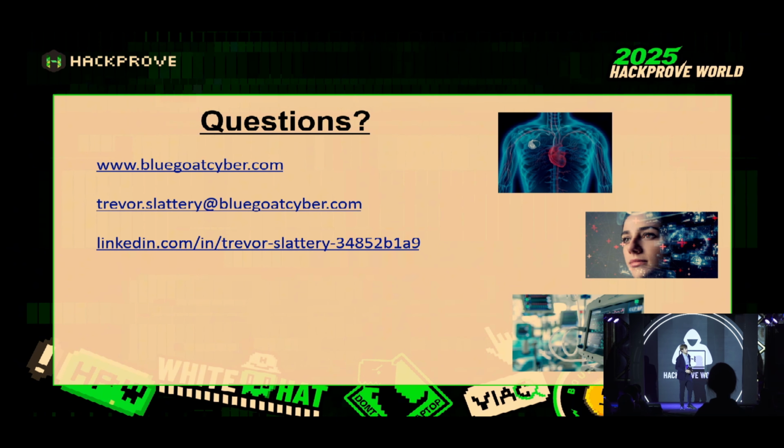Our standard approach, a lot of devices that we deal with, especially modern devices, are like an AI-enabled diagnosis platform or a software as a medical device. We'll usually use a couple of different approaches. We'll start with the OWASP top 10 to try to tick some easy stuff off the list, move down to STRIDE, try to get some more complicated stuff, finally finish with MITRE ATT&CK when we really, really want to find everything that can be uncovered there. So I'd say the long and short of it is just trying to blend different approaches and get a little bit more of a wide cast on everything.